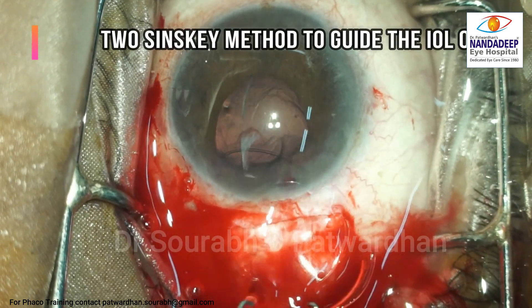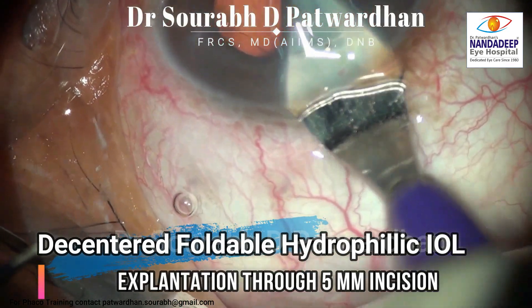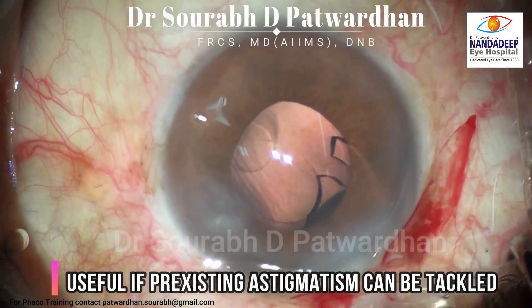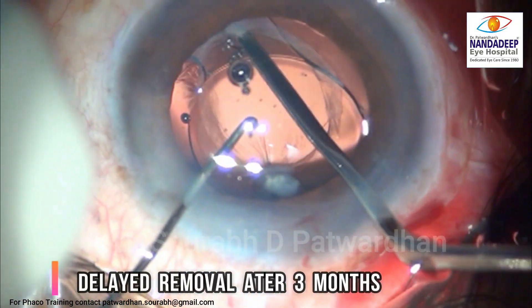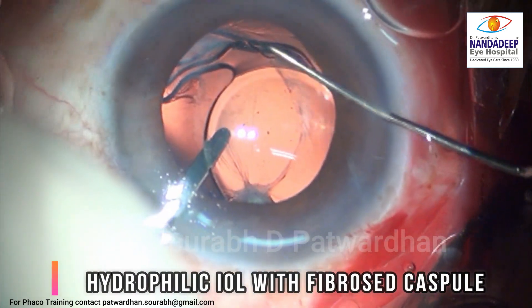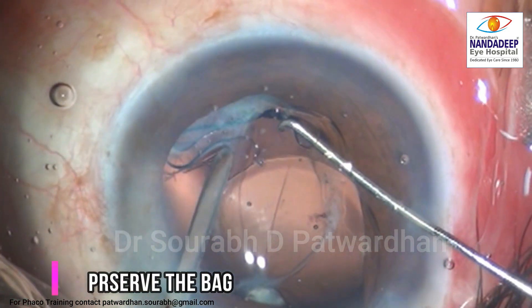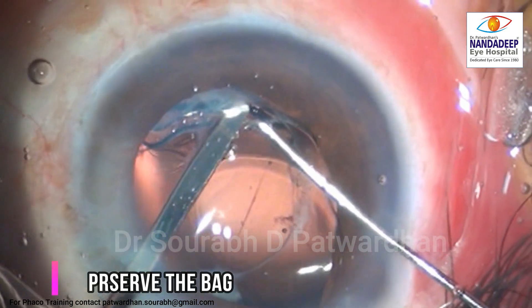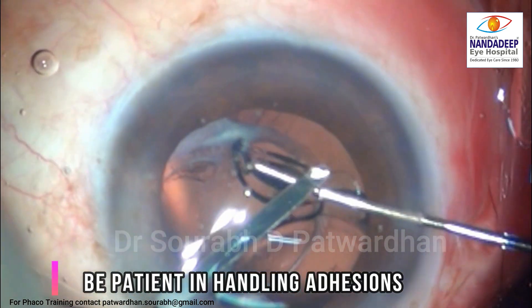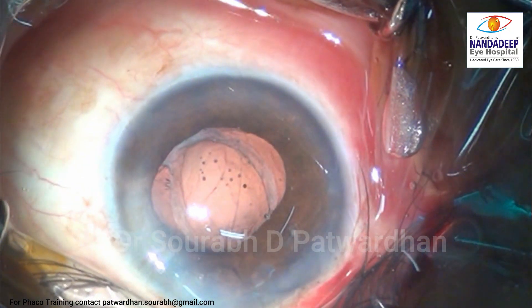This is another method using two Sinskis to guide the IOL out. In cases of decentered hydrophilic IOL — here it's a broken IOL — the easier technique for beginners is to make a scleral tunnel and remove the IOL without cutting it. For hydrophilic IOLs the material generally doesn't stick with the capsule, so they are easier to remove. But sometimes fibrosis occurs over time, so be patient, release the IOL from the fibrosed area, and try to preserve the bag to avoid capsular dialysis.